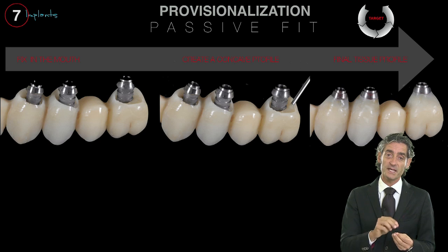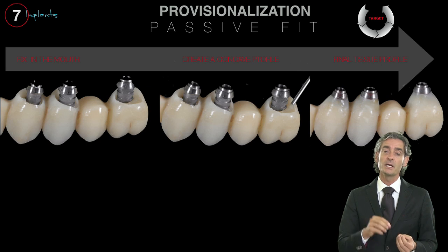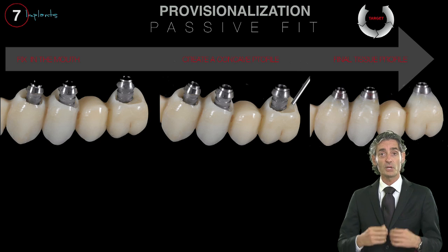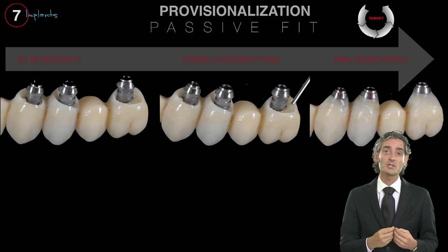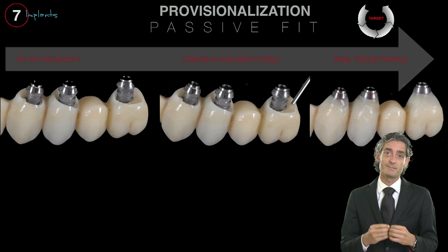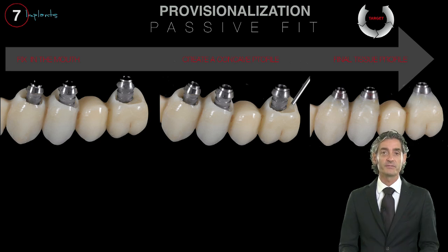And then when we fix the provisional abutment inside the framework through the use of some acrylic, what is important is to avoid having acrylic inside the site of the surgery. Because if we have, for example after an extraction, contamination with this acrylic inside the socket, it's really difficult later on to detect where the acrylic is, because when it's mixed up with the blood, it becomes more or less the same looking as the bone.